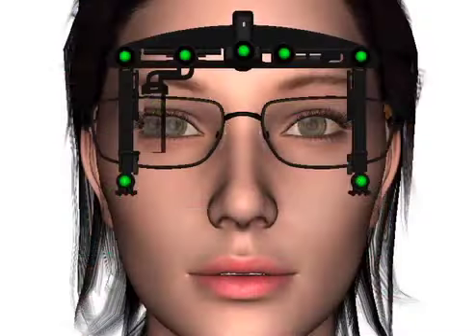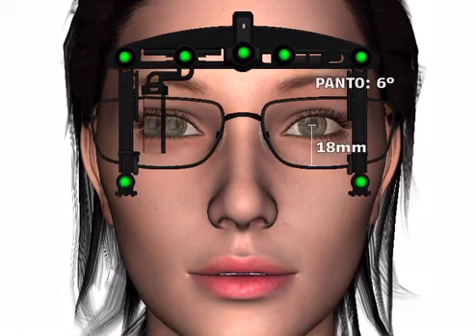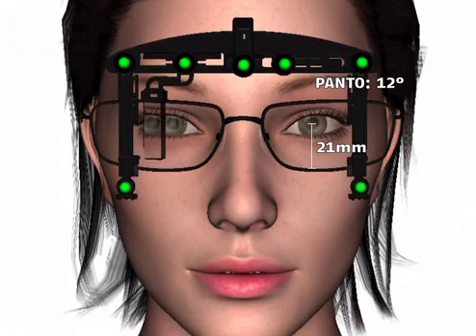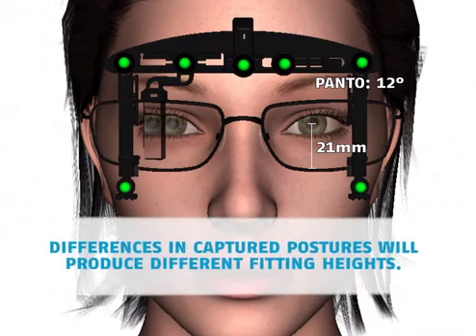Another reason why the app's fitting heights might differ from your manual measurements can be due to captured posture. The posture you place the customer in when taking manual measurements must be the same posture you have captured with the OPD to produce the same fitting height values. Differences in captured postures will produce different fitting heights.